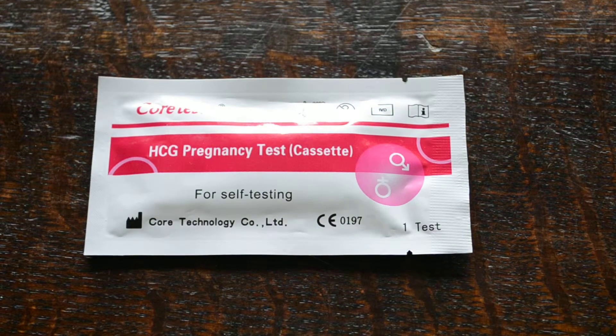Welcome to this video presentation. We're going to show you the CoreTest HCG pregnancy test cassette for self-testing. This is manufactured by CoreTest In Vitro Diagnostics. They manufacture a whole range of self-testing products, test membranes, including this pregnancy test cassette.